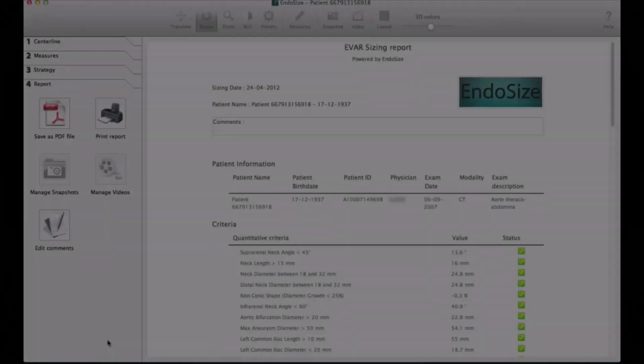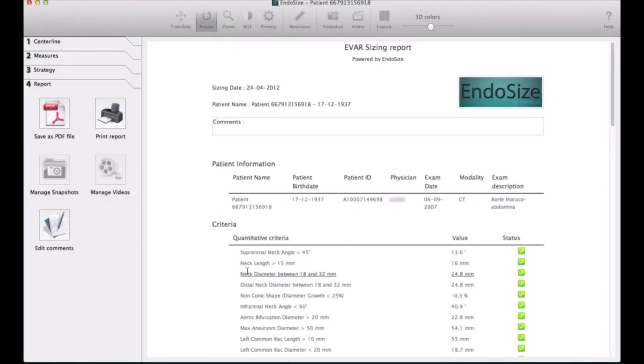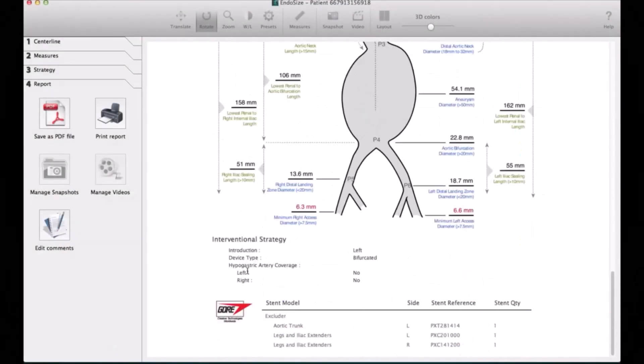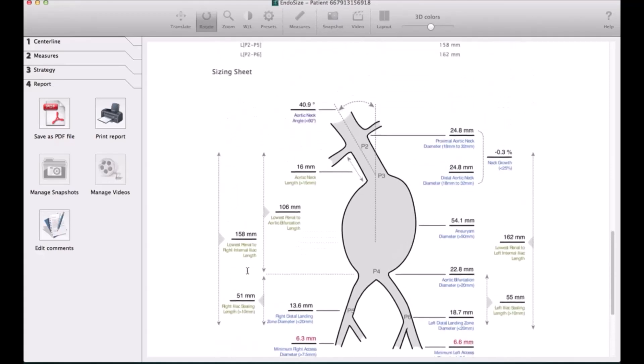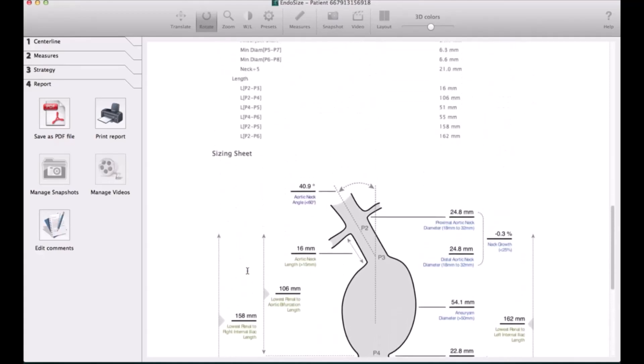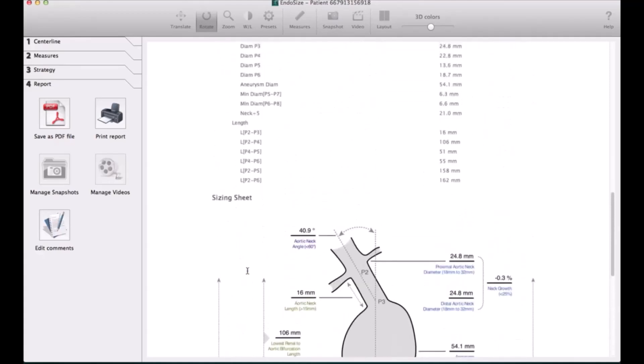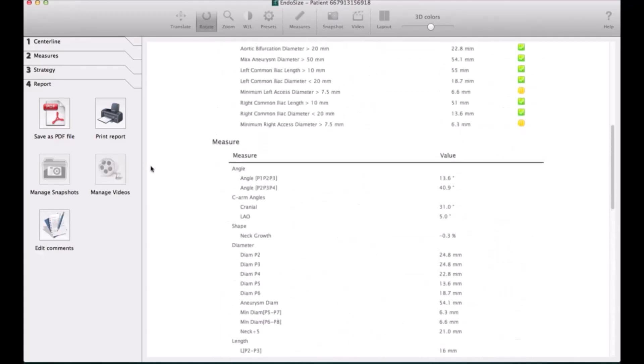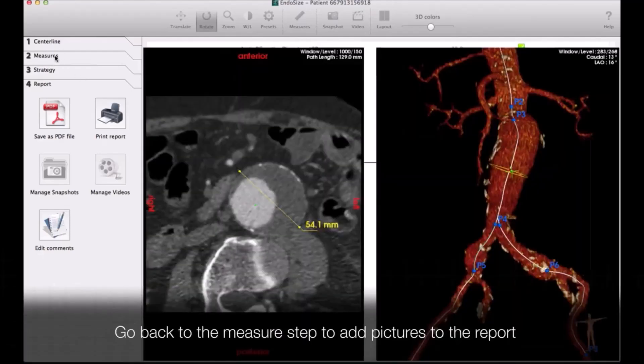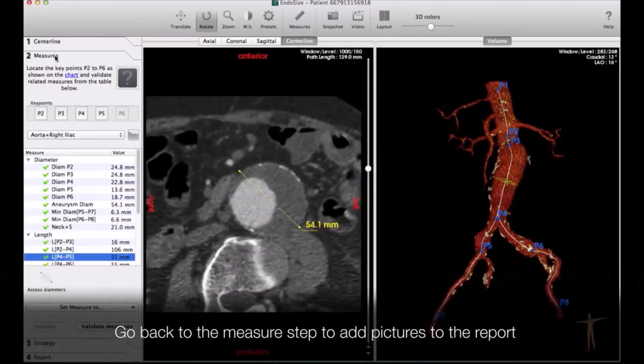It will give you a brilliant report, a very professional report, and the report will come like this with measurement and the company and even the reference number that you are going to use, which is a great help.